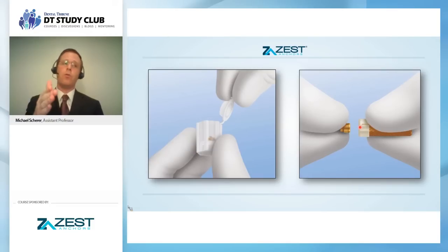Just like we talked about before, where the actual implant will attach into place with the O-ring, the locator will snap into place, so that way you can actually hold it up and down and massage it. So it won't fall on the patient, it won't fall down onto the tongue, and most importantly, you won't lose it down the throat or on the ground.